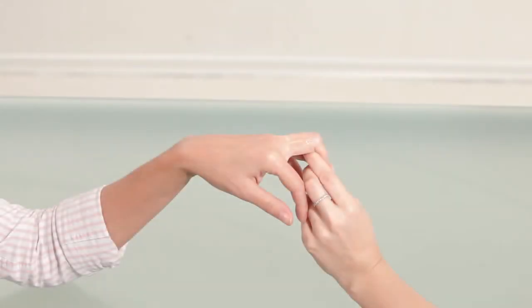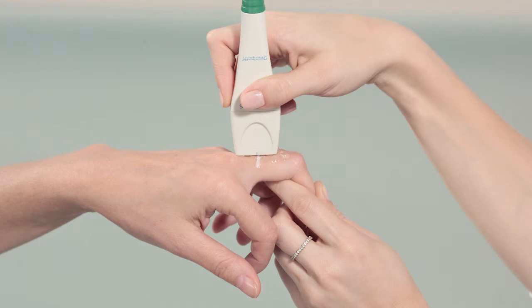Raise the third finger slightly from the desk and hold it in the lateral and medial areas. Place the probe on the medial part of the proximal phalanx, distal to the drawn line. Hold the probe so that fingers 1, 2 and 3 are grasping the base of the probe close to its scanning surface. Press start.